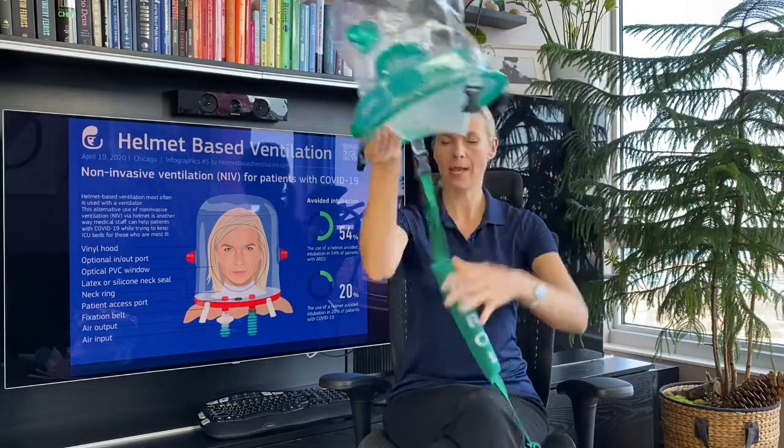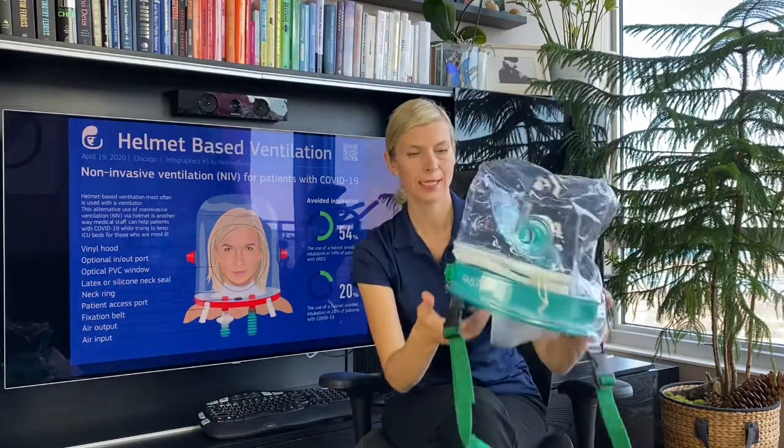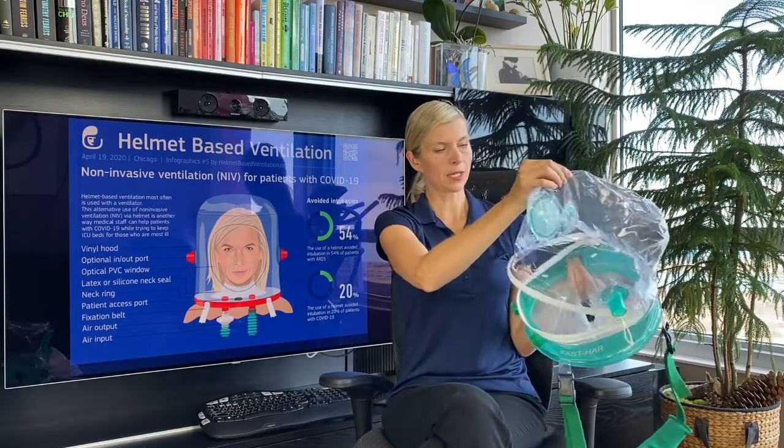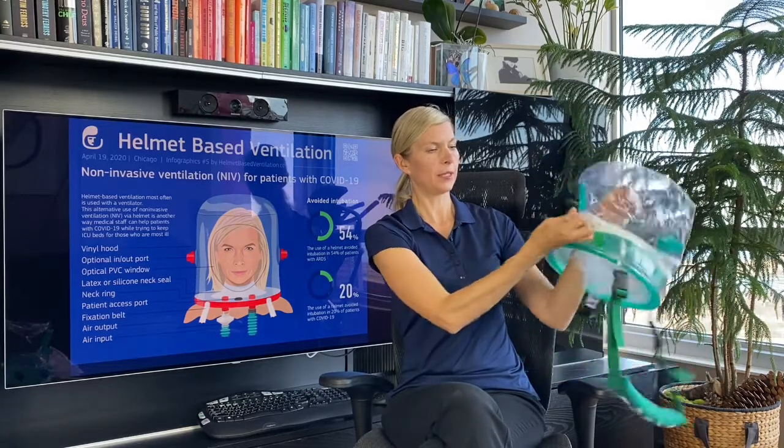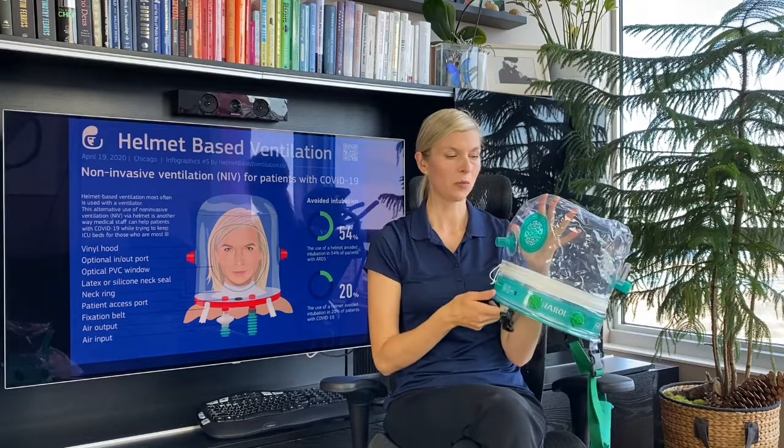The other helmet we have here is the Fast Har. It has one additional built-in feature: a zipper. What is nice about the zipper is that you have full access to the patient's head. In case you need to intubate the patient, you don't have to take the helmet off — you can just open the zipper and intubate. It also has a built-in anti-asphyxiation valve, but don't get confused — it is not a patient access port. It's very different from the One Har design.